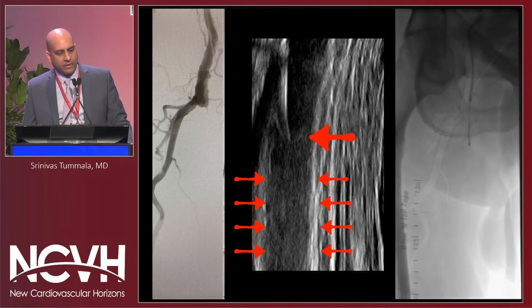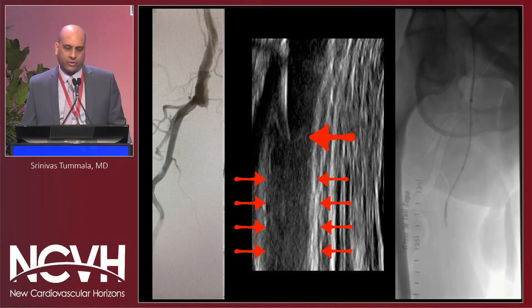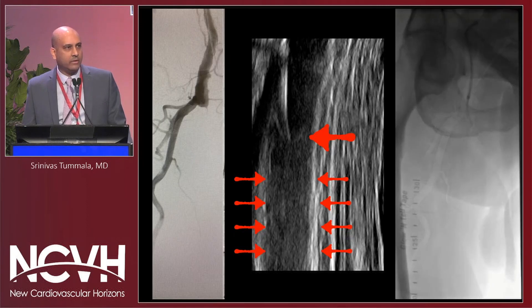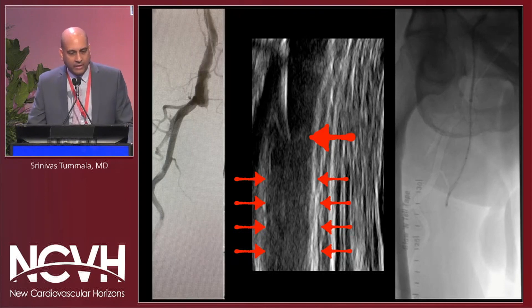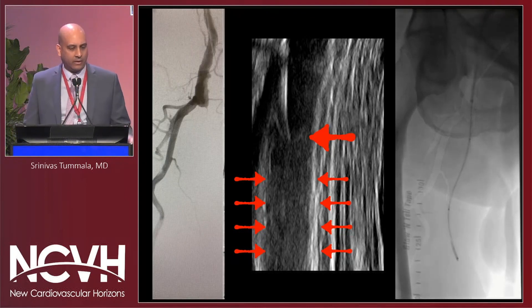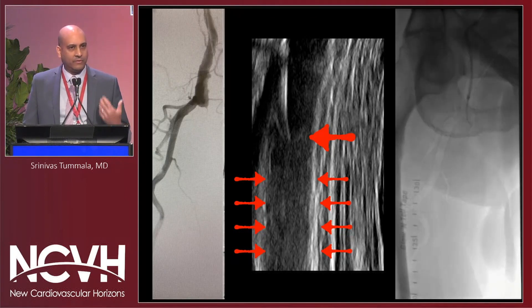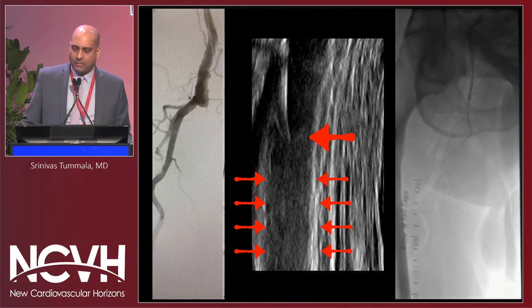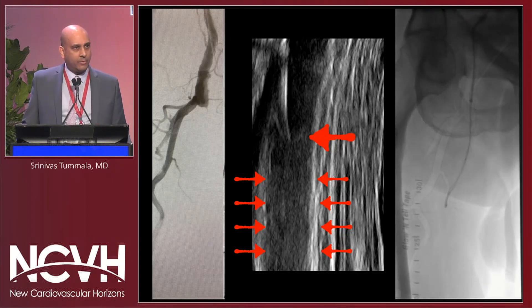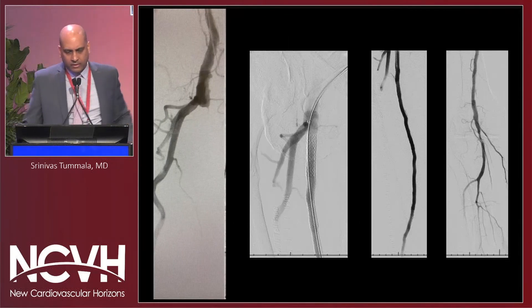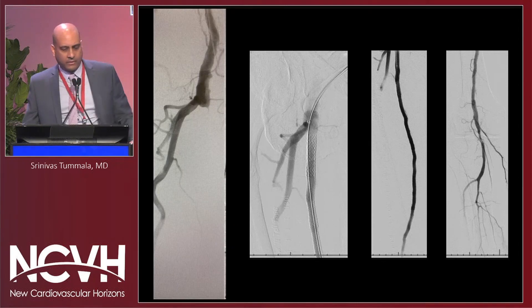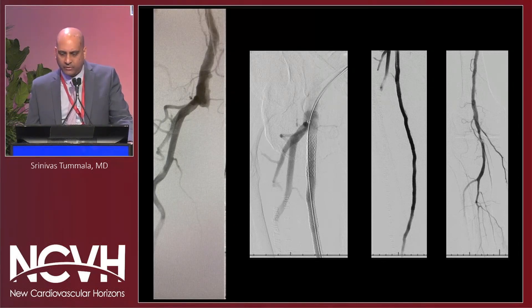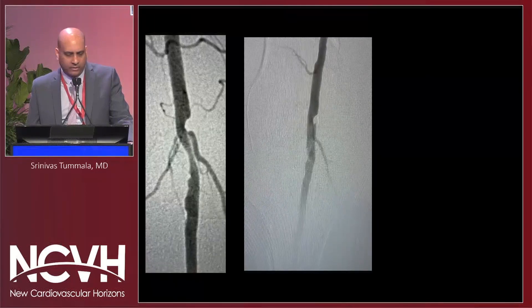Here's a near-flush occlusion. We have an idea of where to probe and start, but look at how well you can see that proximal cap and its morphology using extravascular ultrasound. There's no guessing where the profunda origin is and no guessing whether I'm sub-intimal when starting the recanalization — because you don't want to compromise that deep femoral artery when delivering therapy. We were able to stent that proximal segment and really deliver therapy in good fashion.